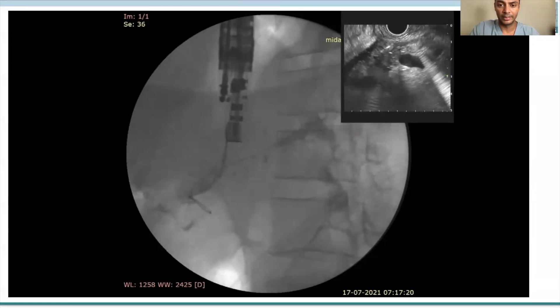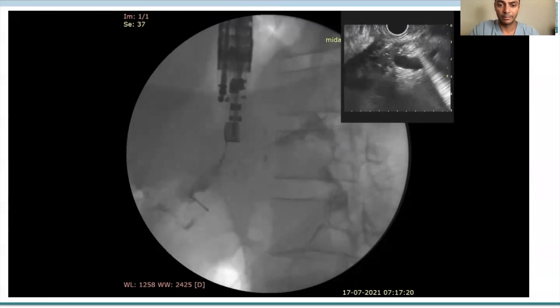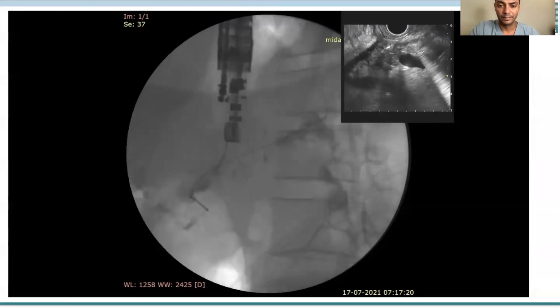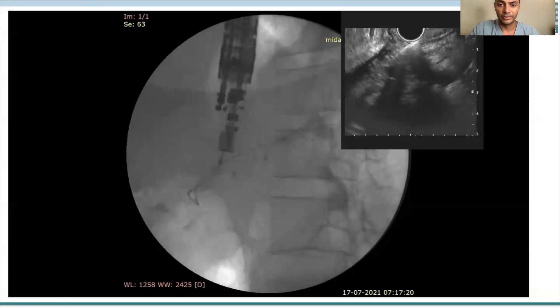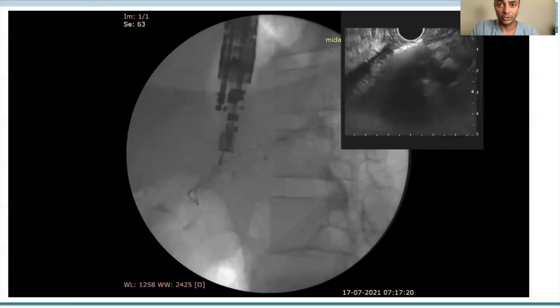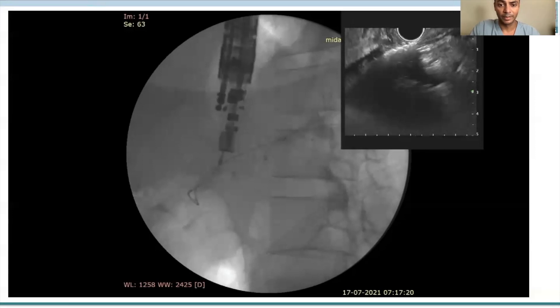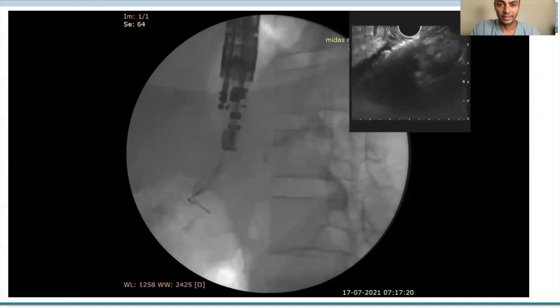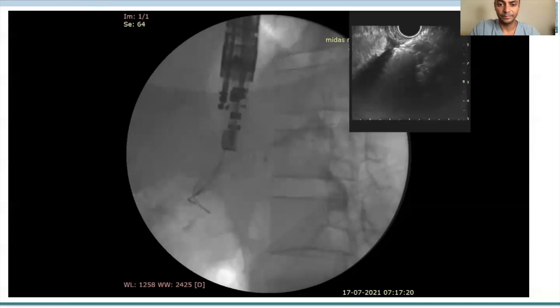We tried to coil the guidewire across the papilla, but it was not successful. Next, we used a 6-French cystotome to create a fistula tract between the stomach and the pancreatic duct. This was successfully done.